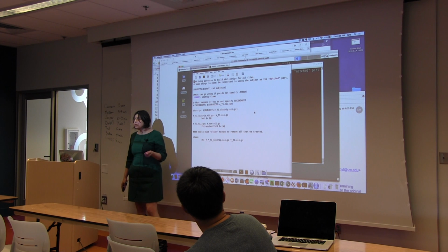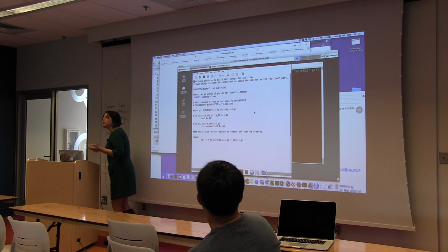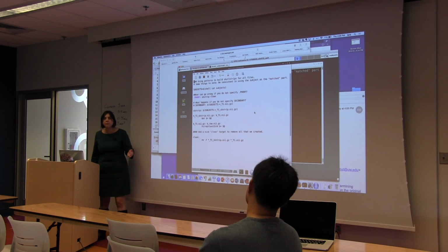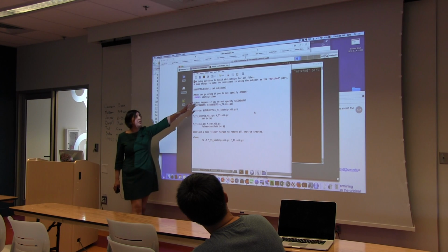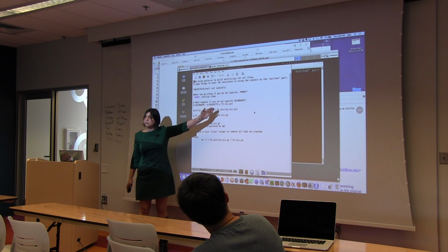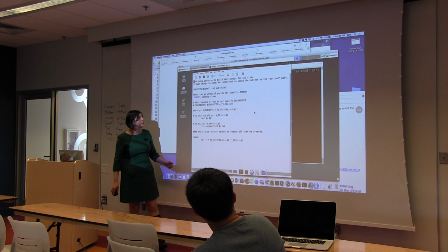But I found that what's kind of nice, especially for established projects, is to have a fixed list of subjects, because you just want to know who you're dealing with and not worry about errors caused by that person who has the missing, whatever it is, the missing B0 field map or something. You can't do their resting state processing, whatever. You just want to know who you've got in and keep that the same. So I often just like this one. I like to just cat a file called subjects, which has a list of subject IDs. Very easy to make, and then you have it for all different purposes for scripting.